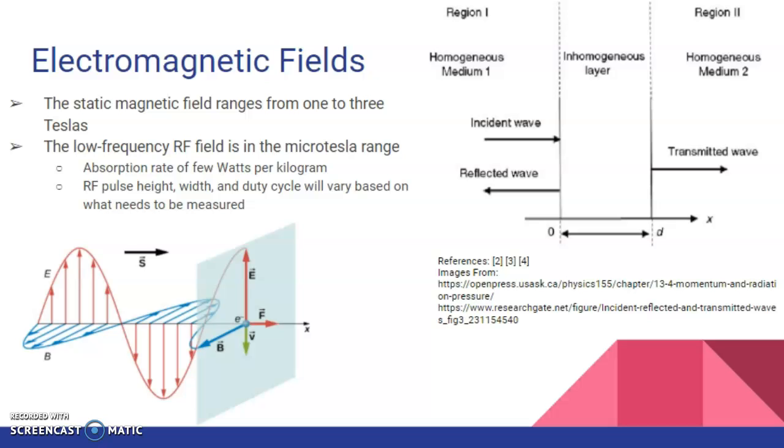Another important class concept occurs when a signal is received after the introduction of the RF wave. The signal recorded by the sensors of the MRI are also electromagnetic fields, which produce an electric current in the device that will be used to transduce into digital values. The electric current produced in the device is based upon the principles of Lenz's law, which states that the generated current is always in the direction that opposes the change of magnetic flux.